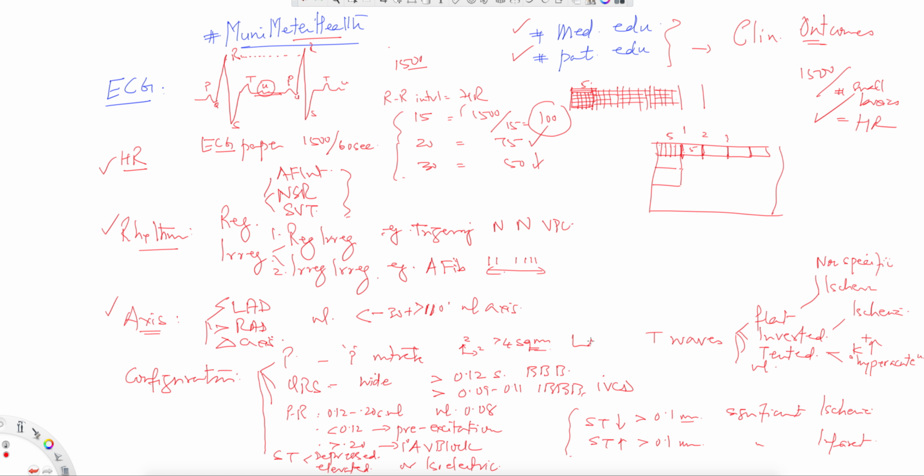When you have a left atrium which is very, very large, you will expect the P mitral to occur, and that is about 2 boxes up and 2 boxes down. So the P wave that we are just talking about here is either 2 boxes up and 2 boxes down. That's almost like 4 square millimeters. So just so that you know, for 4 square millimeters, you can have a P mitral by definition.